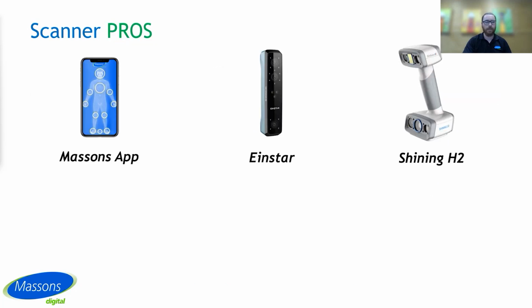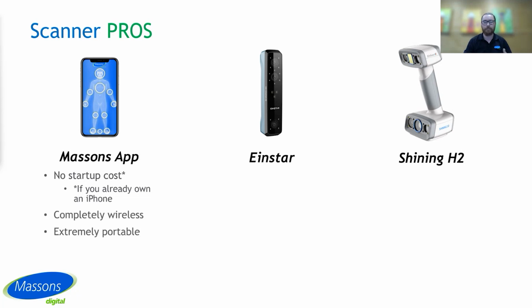So I want to talk a bit about the pros and cons of each scanner. Great thing for the app is if you have an iPhone, you can scan, and it's not going to cost you absolutely anything out of pocket to get started. It's also completely wireless, and that makes it really portable. Your phone lives in your pocket. If it's well charged, you have a few hours of battery life. So really fantastic if you're on the road and you just need to scan something really quick.